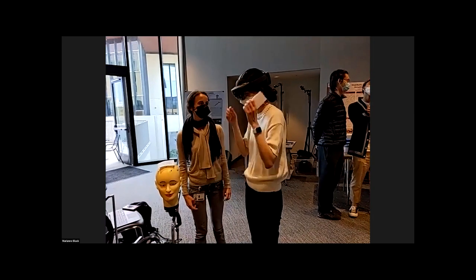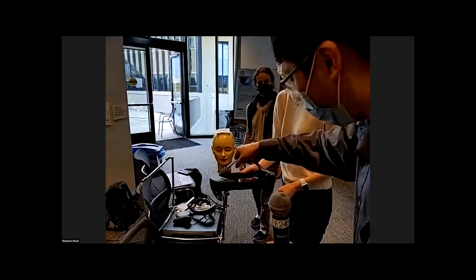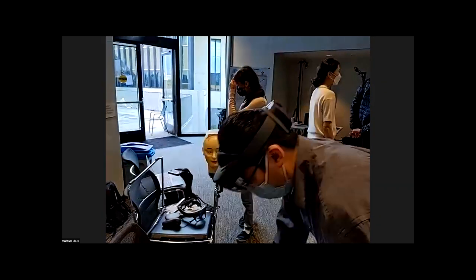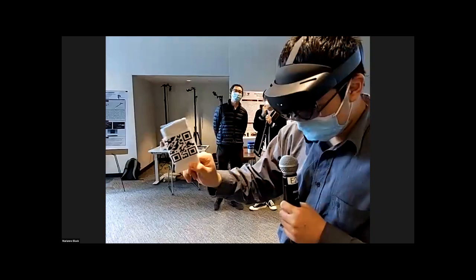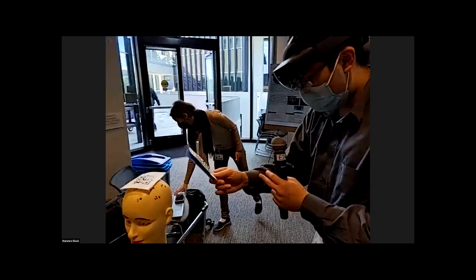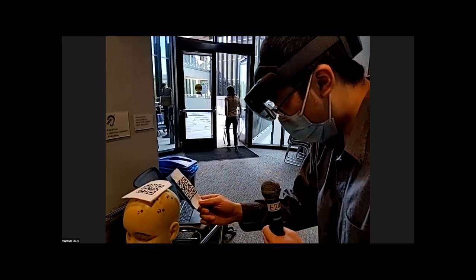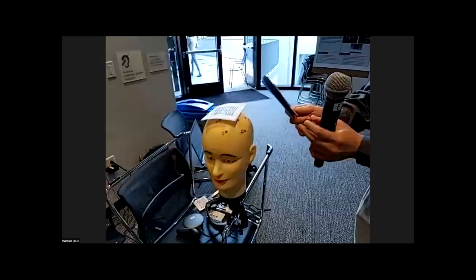The other step would be to actually fire a probe. Sorry if you don't mind me grabbing this. Unfortunately, we do not have an actual coil right now, but for the purpose of this, you can pretend that this is a TMS coil. The idea is that with this little marker, we can actually track where the probe is in real life. Then we can start the actual procedure. We can place this on top of a person's head, and normally there is a button on the probe. We press that and it fires. We do not have an actual probe, but we can simulate a firing event.